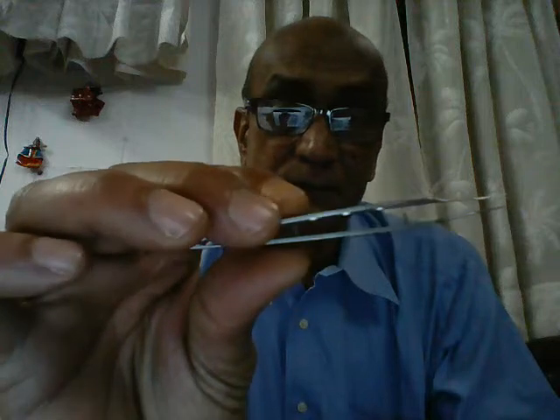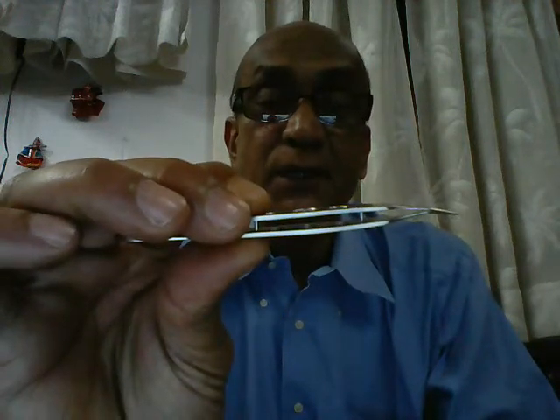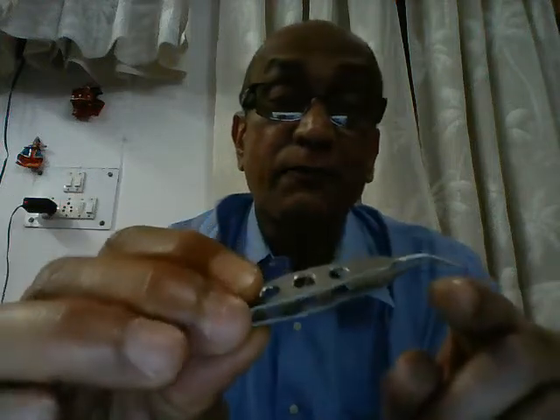A few quick points about this instrument. If you take a look at the prongs of the instrument, they've got very big guards. This is to ensure that we do not inadvertently apply too much pressure, because if we do so we might damage the lens.